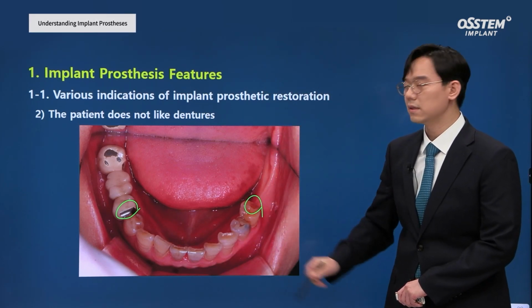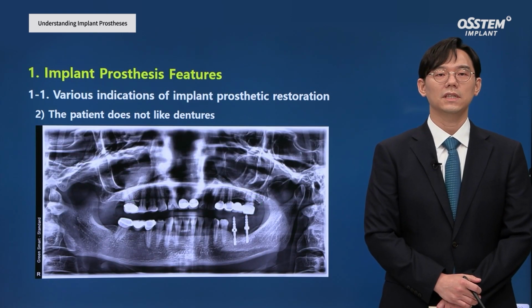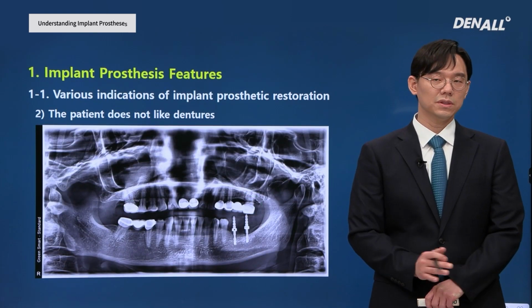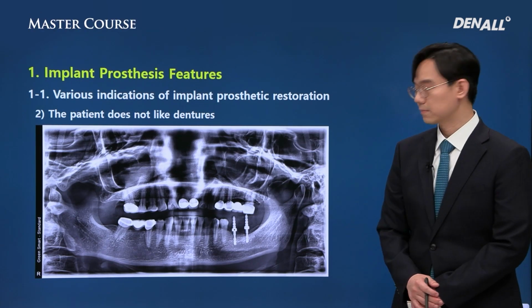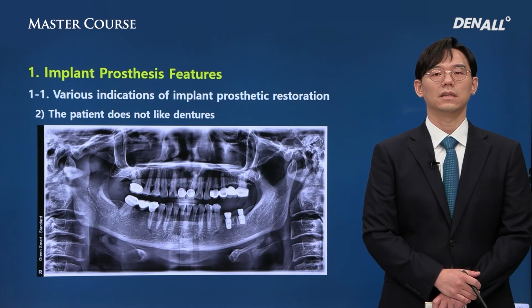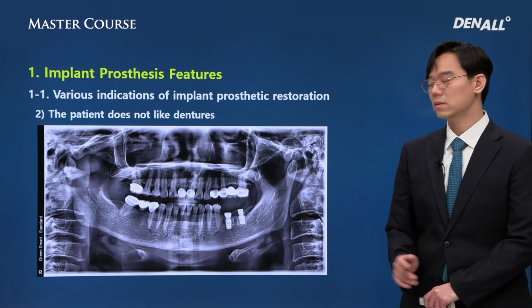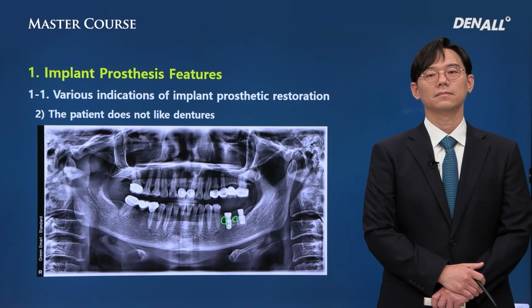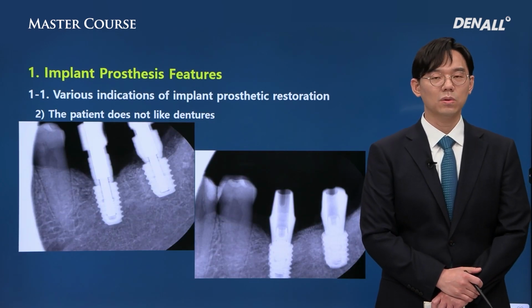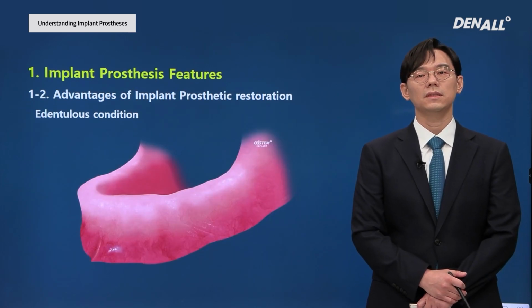In number 35, there is a rest. Initial drilling is done in order to check position and path. Guide pin was placed and panoramic image was taken. This is a final placement image. Because the bone was thin, bone graft was done together. In the panoramic image in number 36, you can see signs of decortication. In the conventional way, pickup impression was taken and prosthesis was delivered.